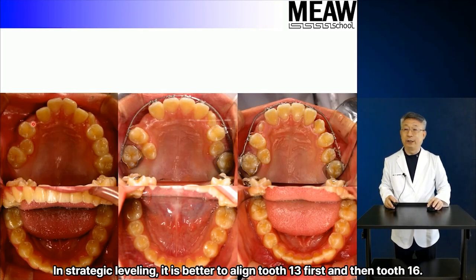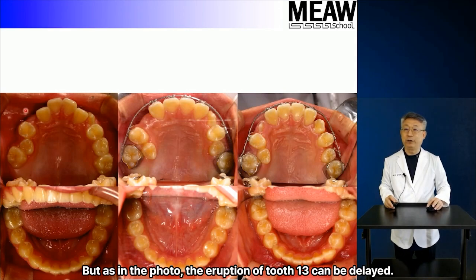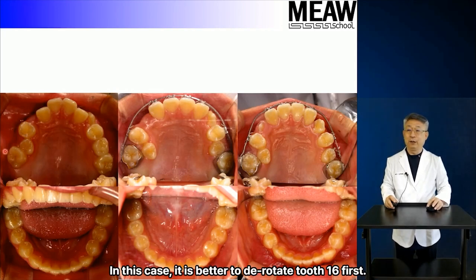In strategic leveling, it is better to align tooth 13 first and then tooth 16. But as in the photo, the eruption of tooth 13 can be delayed. In this case, it is better to derotate tooth 16 first.